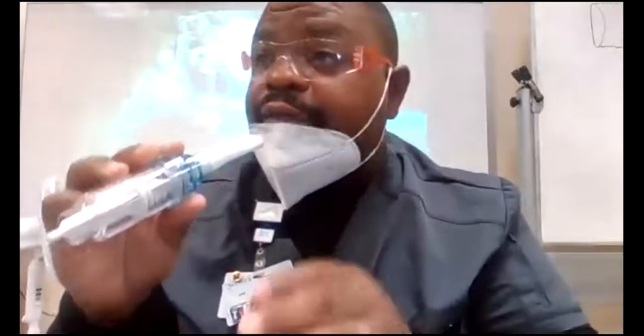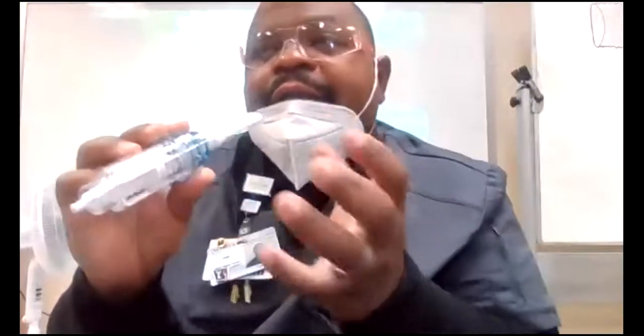Let me tell you what happens during PEP therapy. When the patient blows into the device, the back pressure goes back into the alveoli and gets behind the secretions, okay? So it hyperinflates that alveoli right quick, and the secretions are just stuck in midair, right? And the air gets behind the secretions, that way it can push them up out of the alveoli, okay? That's what's happening on PEP therapy, okay?